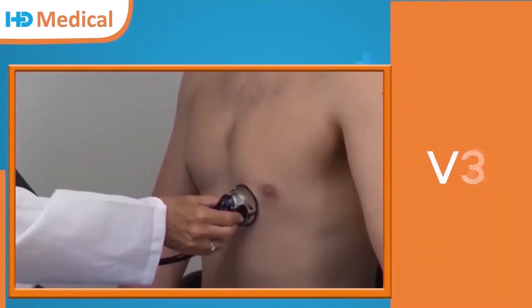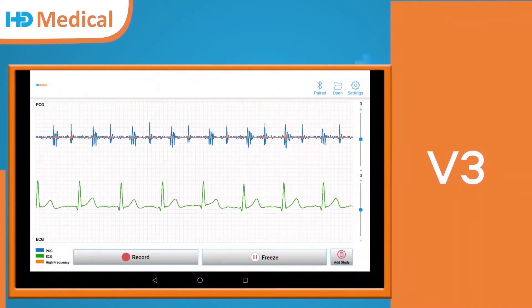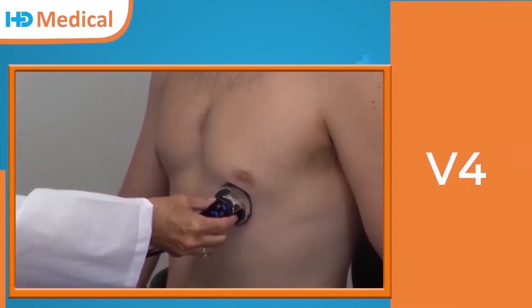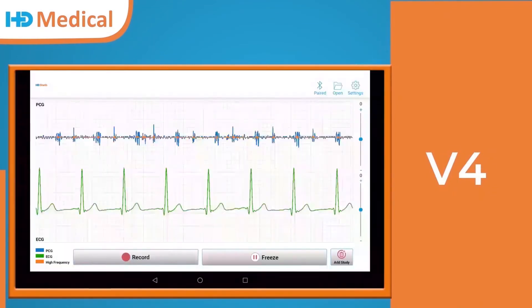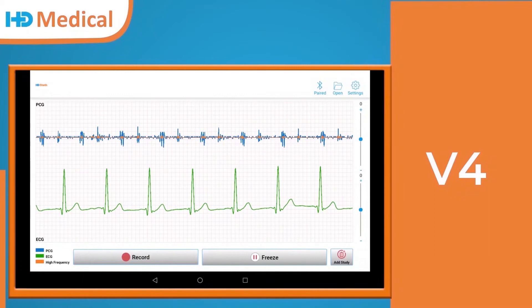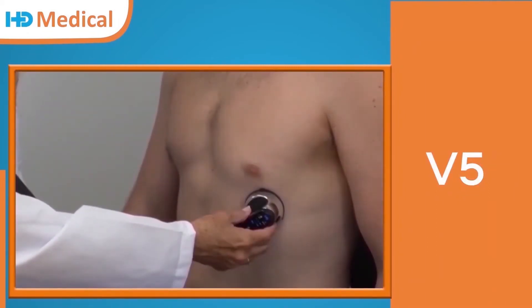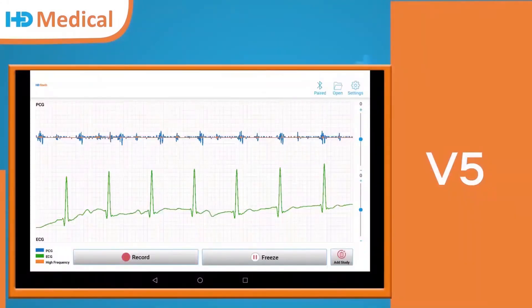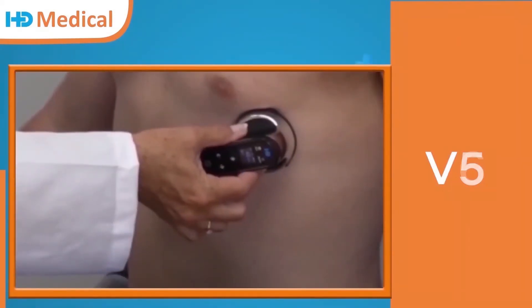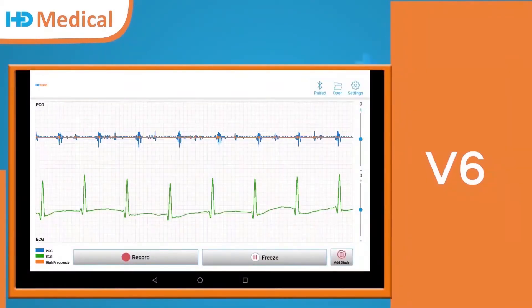ECG vector point V3. V3 waveform. ECG vector point V4. V4 waveform. ECG vector point V5 waveform. ECG vector point V6 waveform.